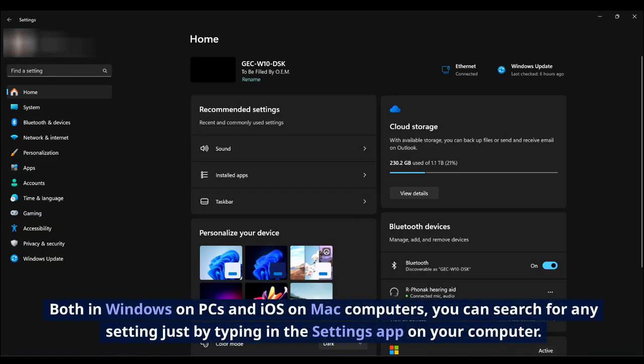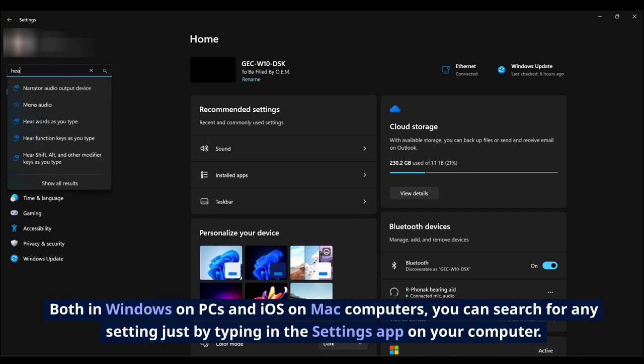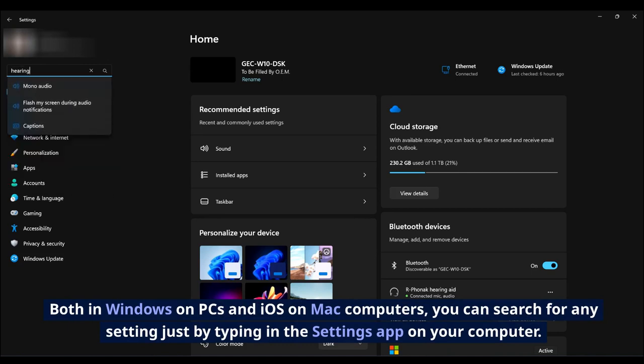Both in Windows on PCs and iOS on Mac computers, you can search for any setting just by typing in the Settings app on your computer.